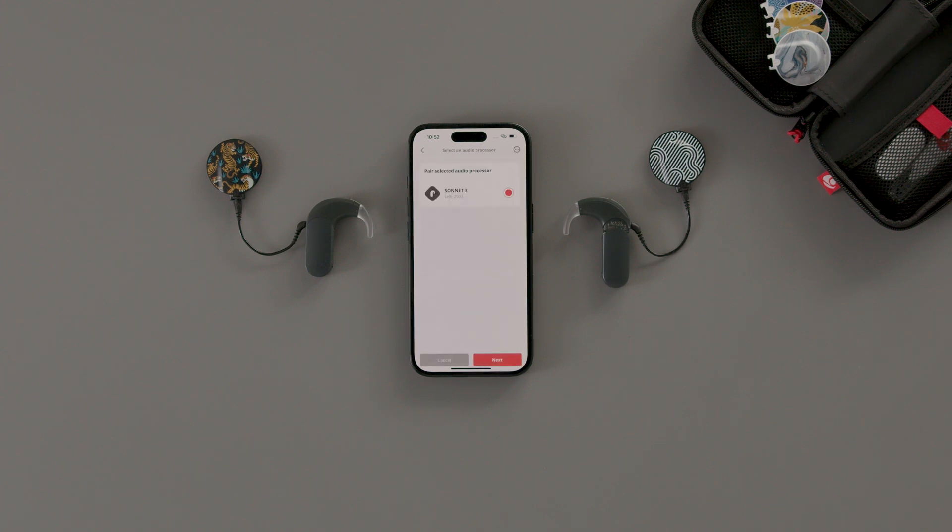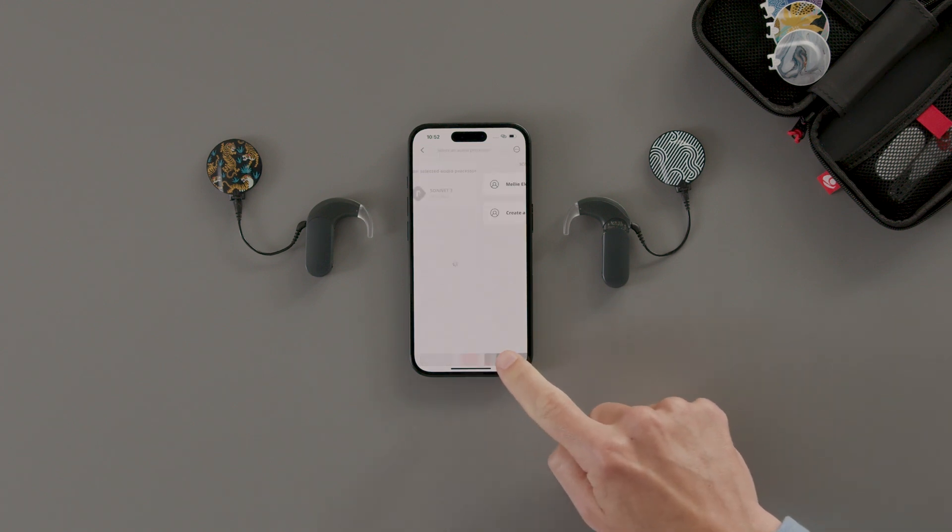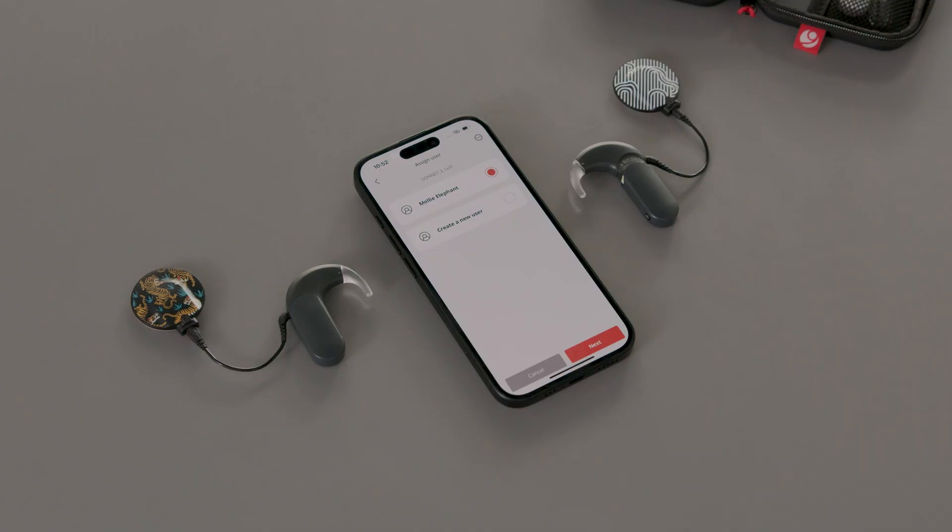Once your audio processor is paired, tap Next. Assign a user to the audio processor. If the audio processor belongs to your child, or someone you look after, tap Create User.